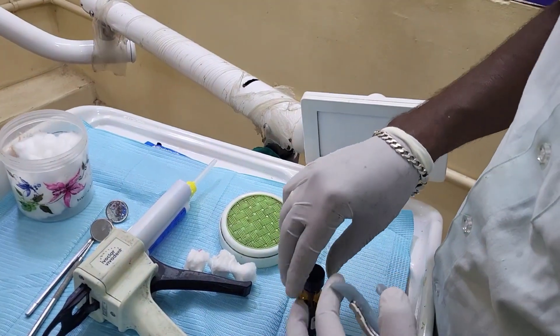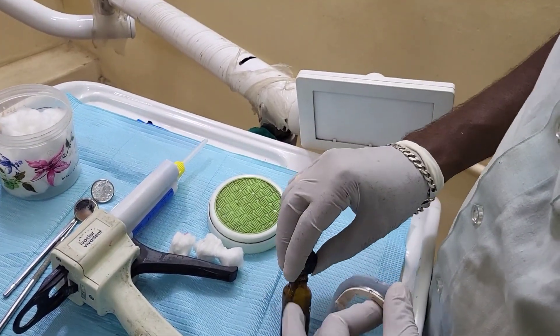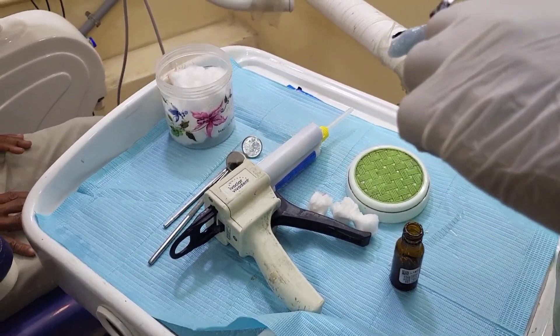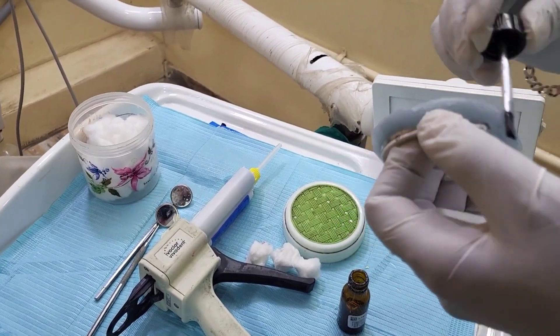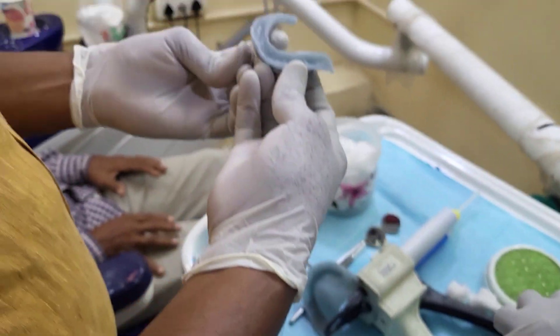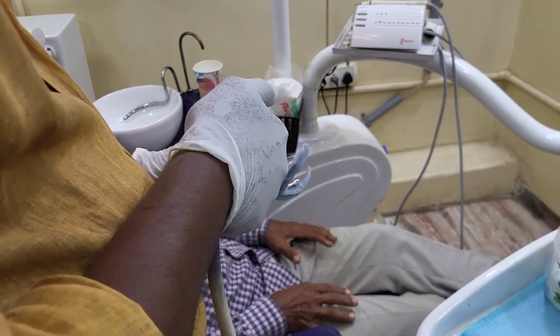Now we have to apply the tray adhesive all over the surface of the borders and the tray. Next, we have to air dry the tray adhesive.